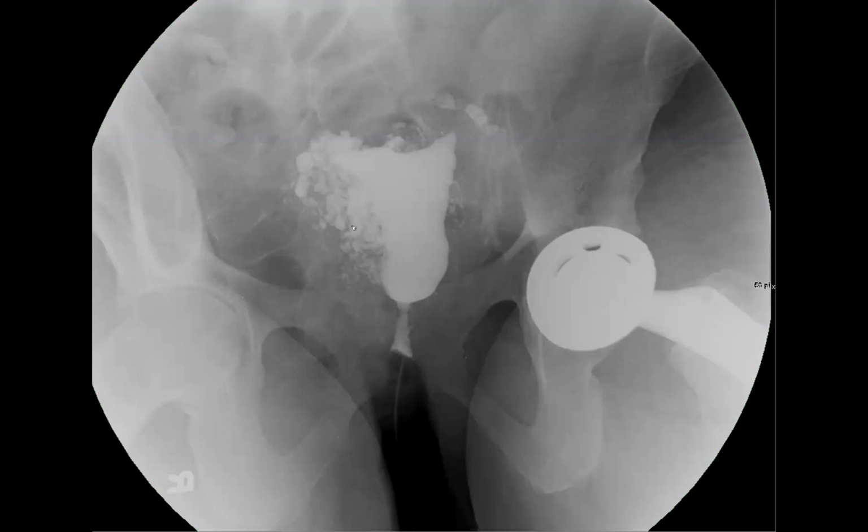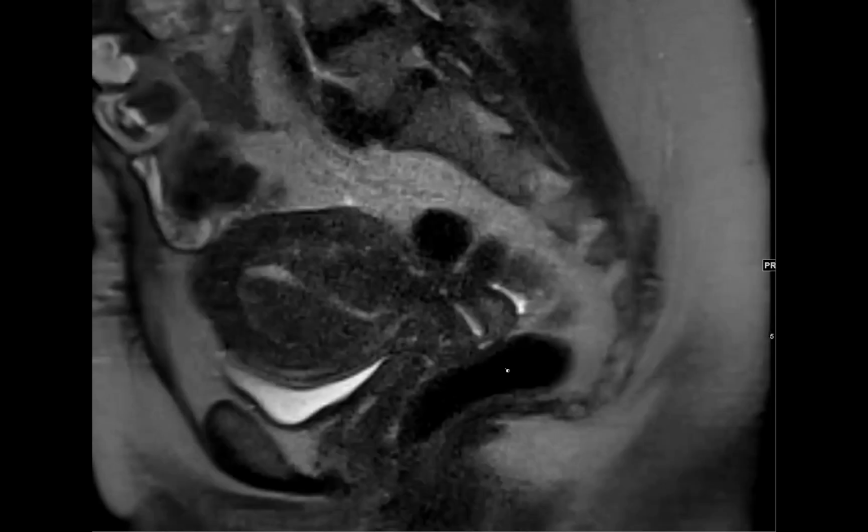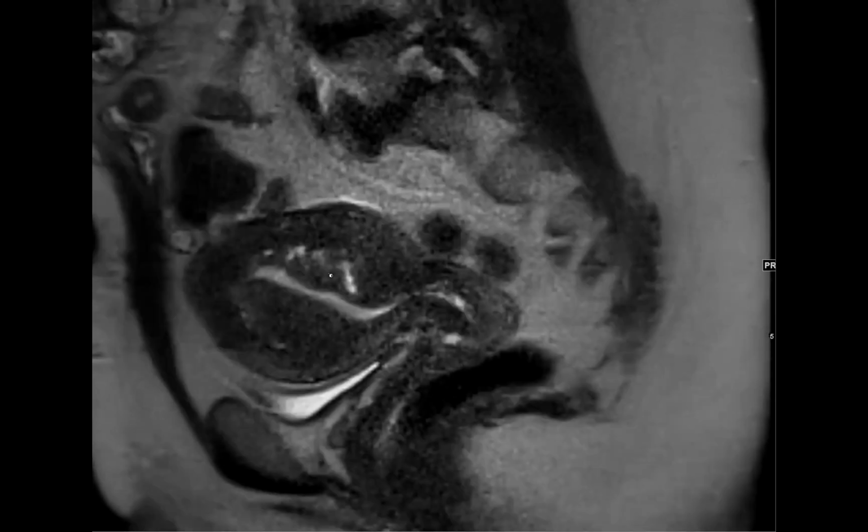I'd never seen anything like this. My colleague was just showing us this the other day. This was actually severe adenomyosis, which is when the endometrial tissue invades into the myometrium. And it's communicating. Usually on MR we see cystic change in the myometrium, but in this case the endometrium is completely communicating with it. I do have the MRI correlate for this patient. So this is a nice example of adenomyosis.